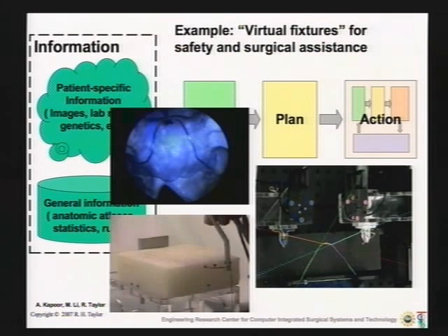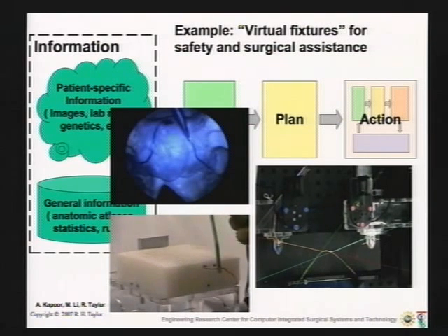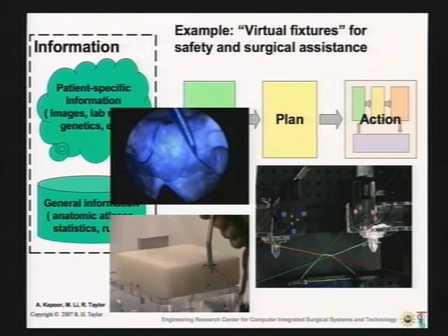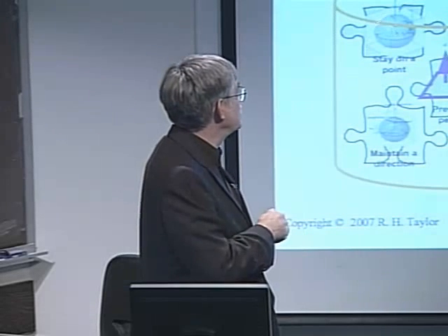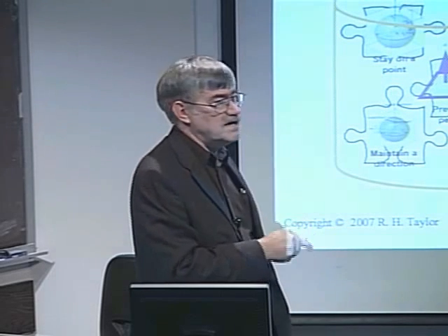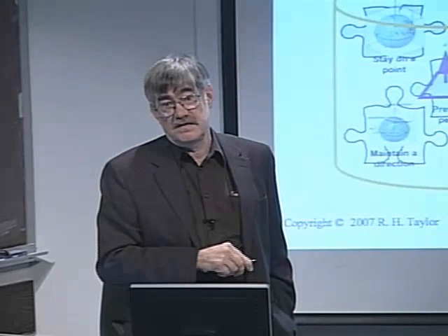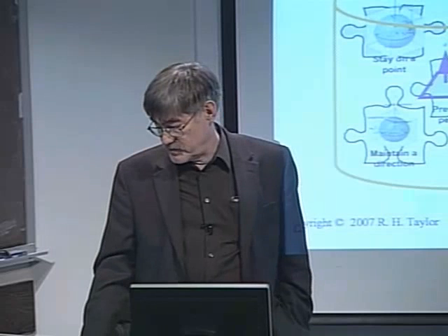which, again, we have a way of solving all of the rather complex constrained behavior as nonlinear optimization problems. And just to show a couple examples. So the idea is that you can break down a rather complicated surgical gesture into very small components that each has its own little set of constraints and objective functions, and you can put all of these together and then very, very efficiently solve a nonlinear optimization problem to let you control the robot.